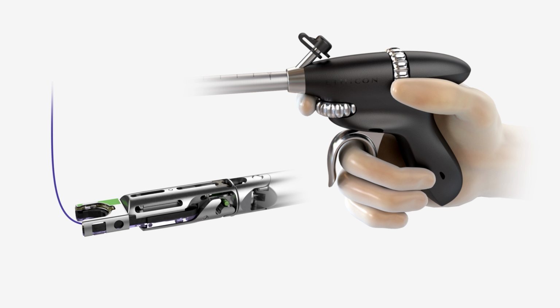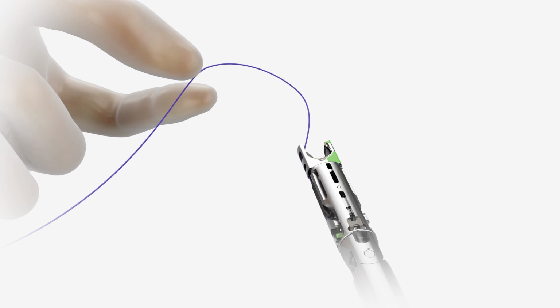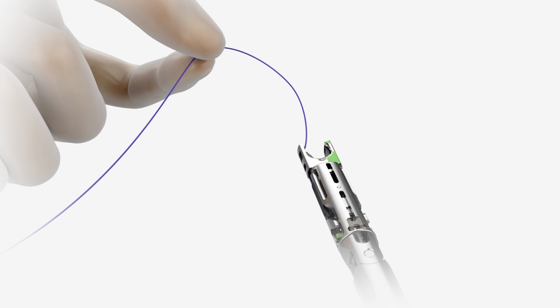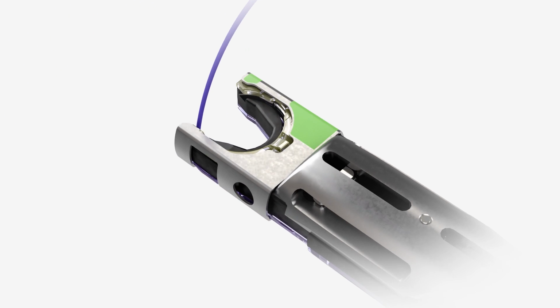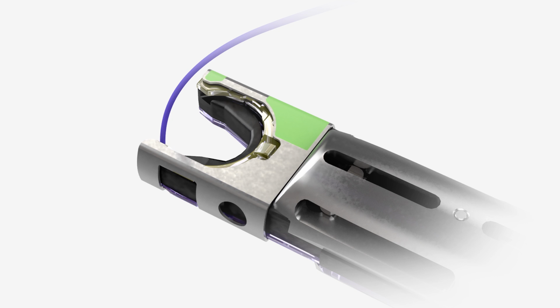To test the needle rotation, load a new suture cartridge. Hold the suture upward and away from the needle track with minimal tension to prevent suture entanglement and potential suture damage. Applying too much tension on the suture during cycling will inhibit movement of the needle.